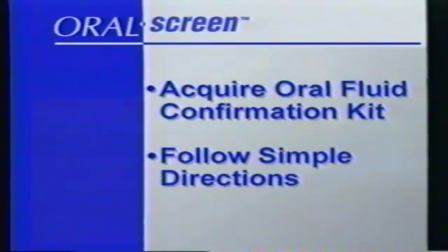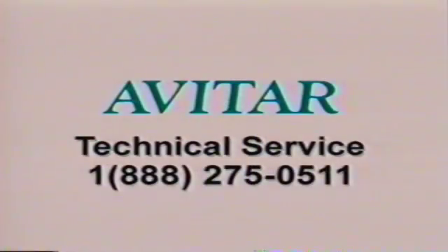This concludes the training program for Oral Screen. We're confident that you're ready to properly use the Oral Screen products. If you do have any questions, please call Avitar's technical service.